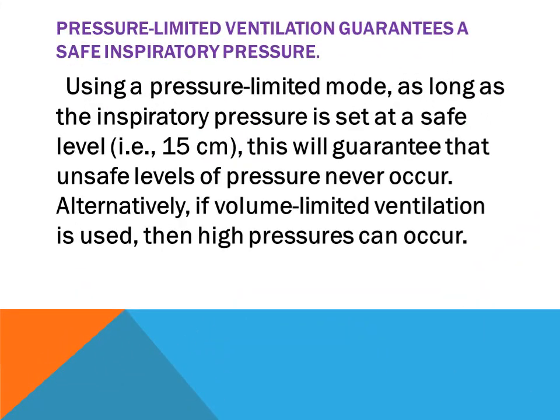Most people opt for pressure limited ventilation because it gives one safe inspiratory pressure. You should keep the inspiratory pressure at a level of 15 centimeters because it will give a safe pressure. Alternatively, with volume limited ventilation, there may be a chance of high pressure occurring.